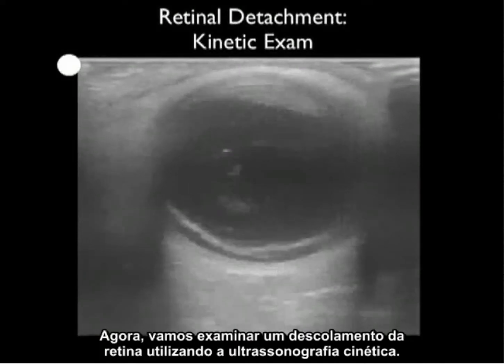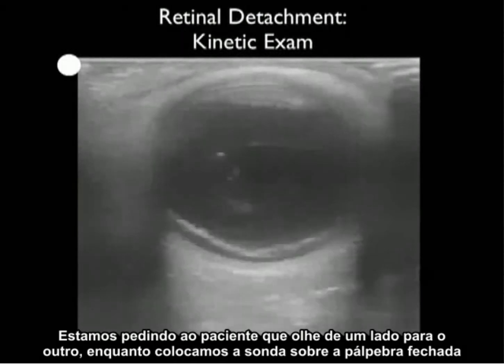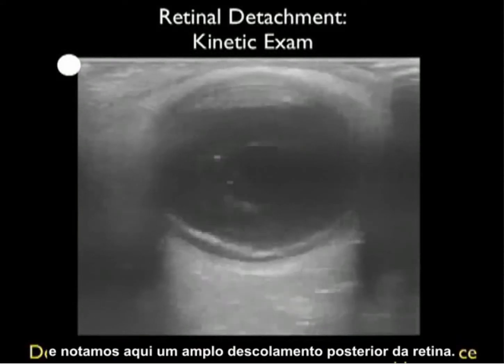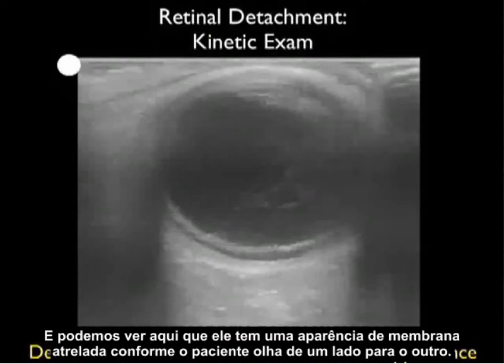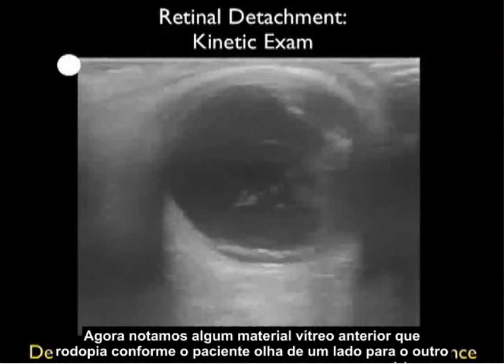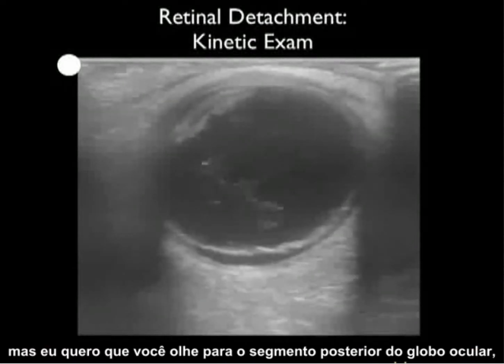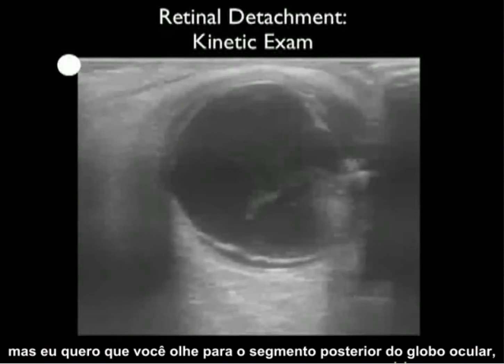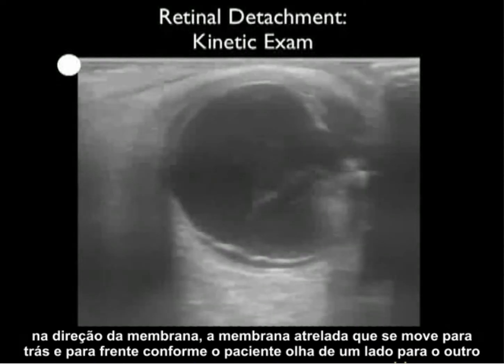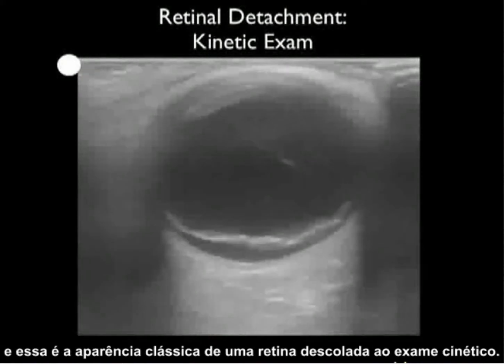Now let's take a look at a retinal detachment using the kinetic ultrasound examination. We're having the patient look from side to side as we place the probe over the closed eyelid, and we note a very large posterior detachment of the retina. We can see that it has a tethered membrane appearance as the patient looks from side to side. Some anterior vitreous material swirls around, but look towards the posterior aspect of the eyeball — that tethered membrane moving back and forth is the classic appearance on kinetic exam of a detached retina.